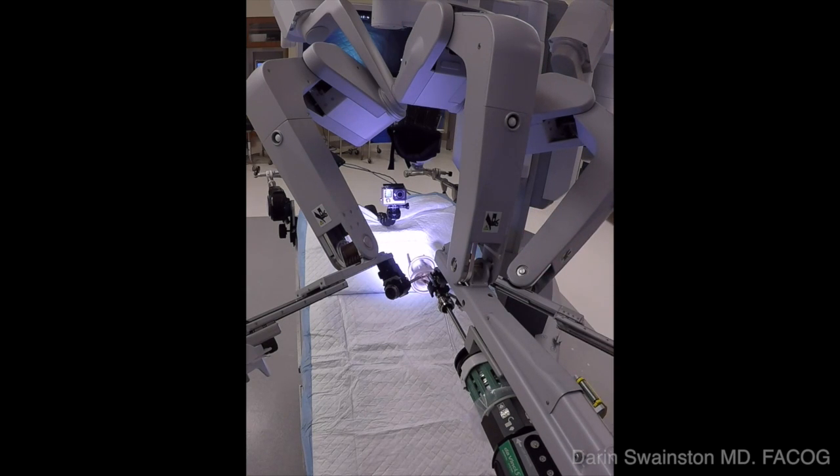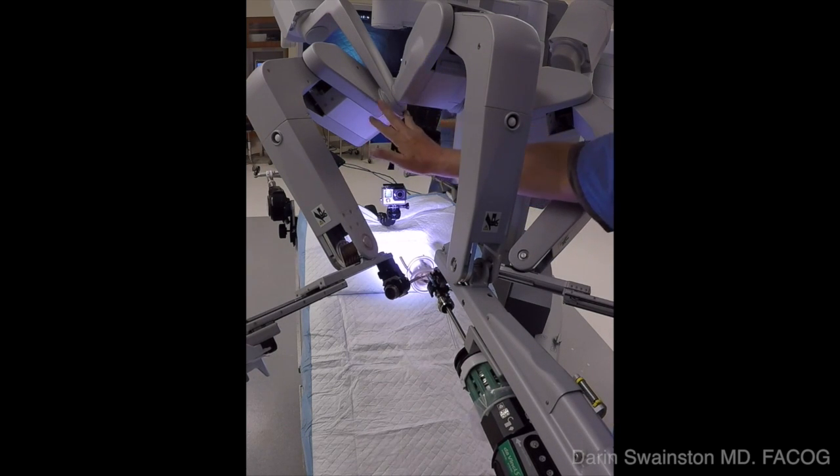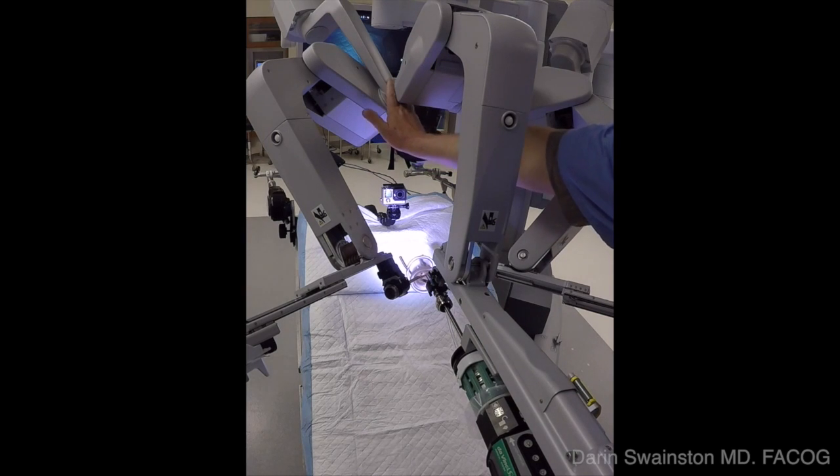Afterward, you can readjust all the arms so that the elbows do not collide as you move from side to side. This is usually done by moving the camera arm. This is a highly effective abbreviated technique.